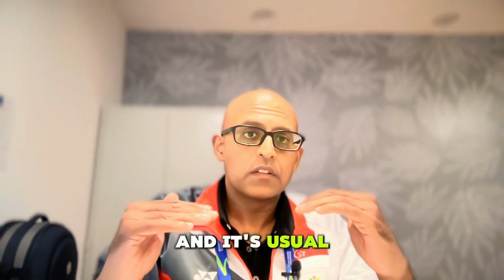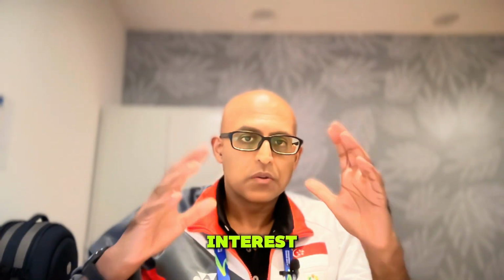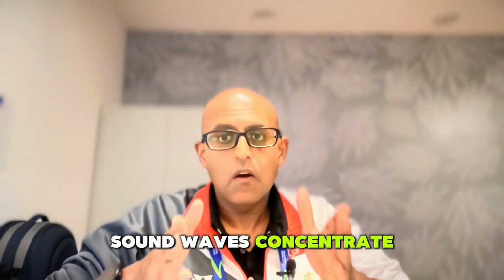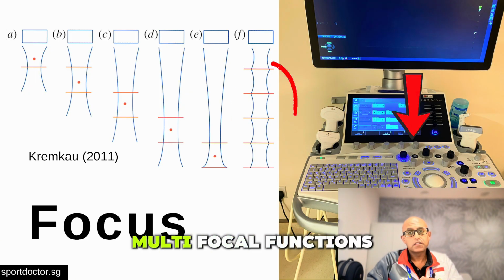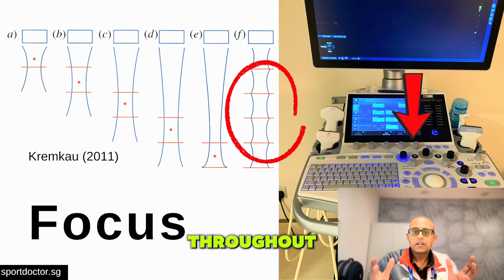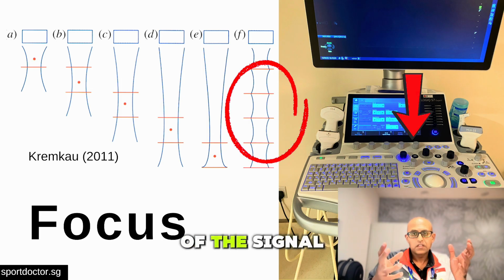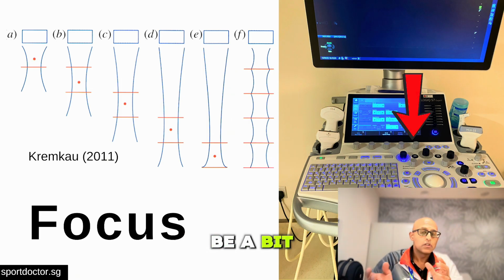And it's usual that we put the focus slightly beneath the area of interest so that the sound waves concentrate on the area of interest, and then we get the optimal image back. Some machines have multifocal functions. While this is great and you get a sharp image throughout, it does mean that the return of the signal is slower, and so the frame rate and the picture may be a bit slow.